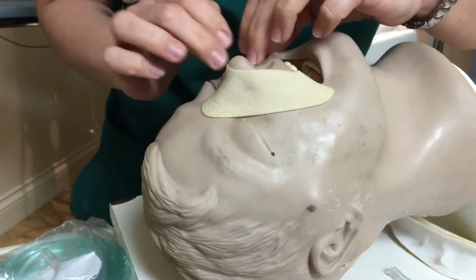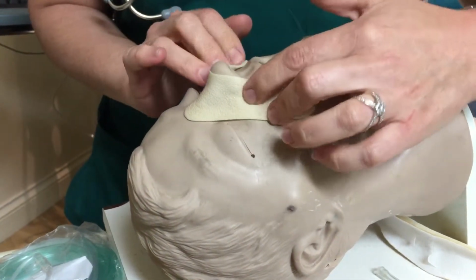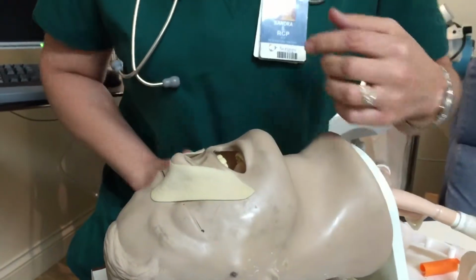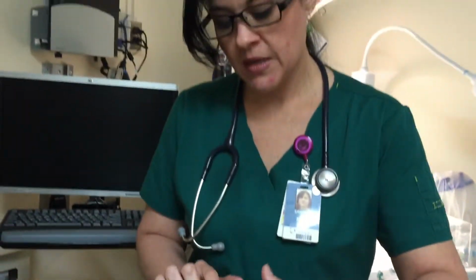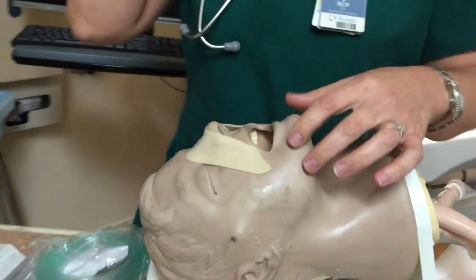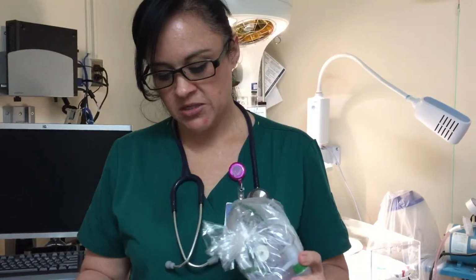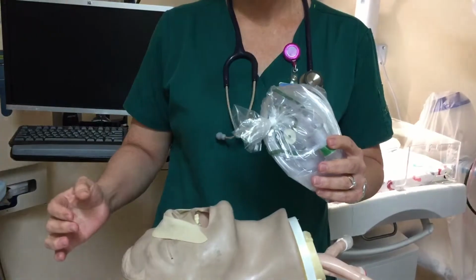So you cut it just the way you would for the BiPAP. If we notice there's redness here or there's redness here, you're more than welcome to cut more Mepilex Light and apply it here. This also applies to the BiPAP. Just as long as it's still blanchable, it's still okay to use a Mepilex. Okay? When on the BiPAP, only once it becomes non-blanchable do we advance to the total face mask. But staying to the oxygen devices, if you see redness, you're going to apply Mepilex to protect the patient.